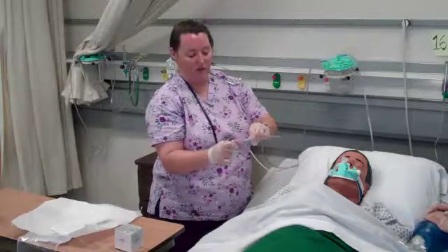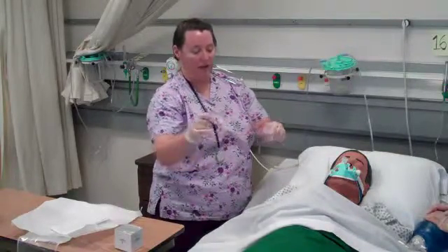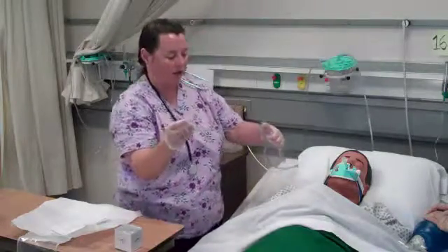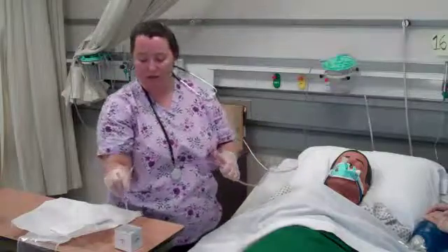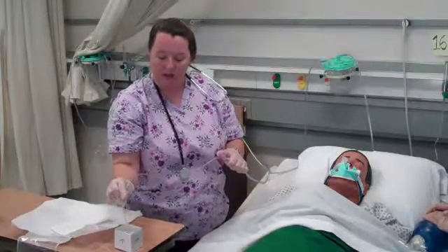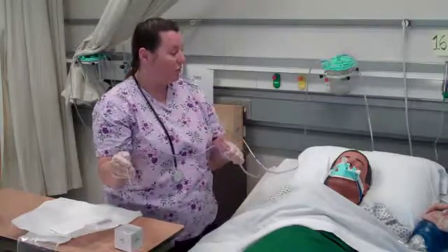I'm going to attach the two connectors together. Again, this is still sterile. This is now clean. My hand can go over the top here. Left hand is now clean only. I'm going to test my vacuum source here. Make sure that the vacuum source is working appropriately.